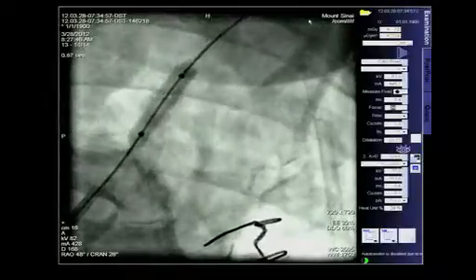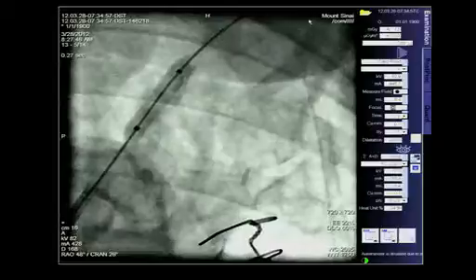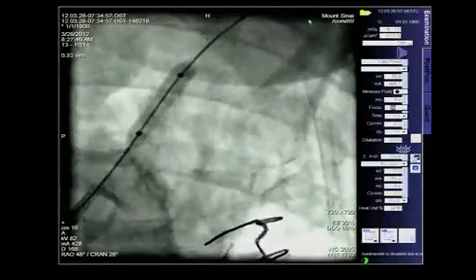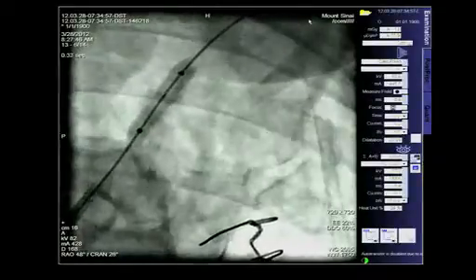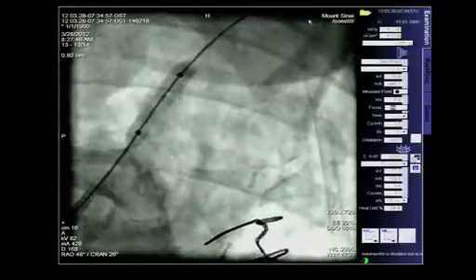So I think if we go up with an 8 mm stent, 8 by 27, like George said, it may be a reasonable stent to go with. We could go with the 7 and then post-dilate to an 8. That's also easily something we can do. But as you know, when you post-dilate, the stent is going to shrink. So you may lose a little bit of length, and you may have to add a second stent.